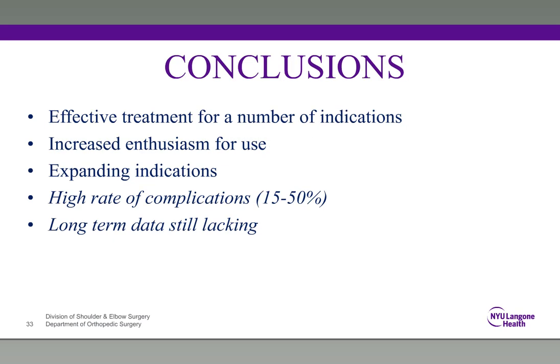So in conclusion, we could certainly see that the number of indications for the use of reverse replacement has clearly expanded, and that has driven the use of reverse replacement. In fact, at this point, reverse replacement has probably overtaken the anatomic replacement in popularity. What we need to understand, however, is that the reverse replacement is associated with a higher rate of complications. Depending on some of the studies that you read, the rate of complication is as high as 50%.